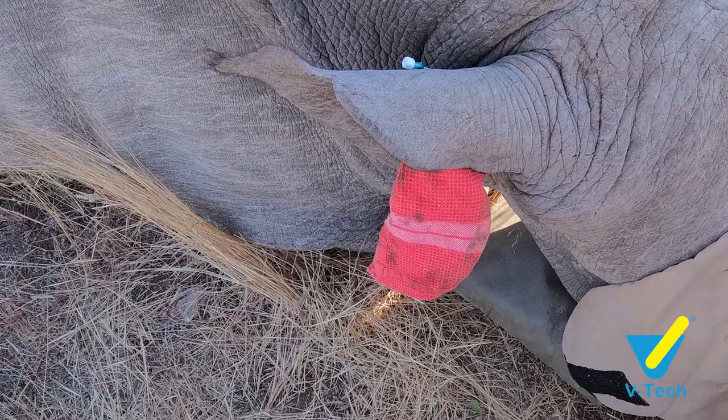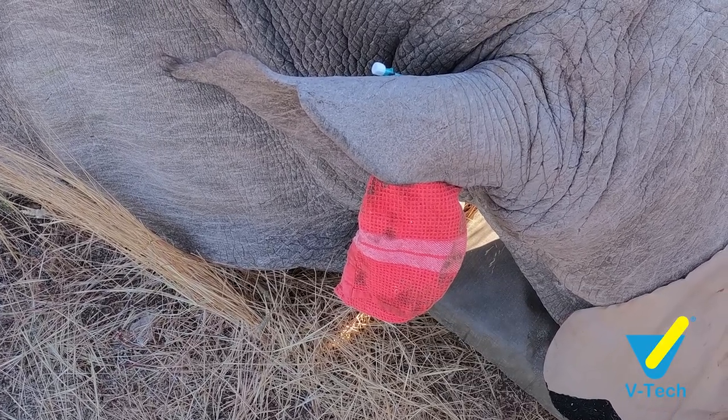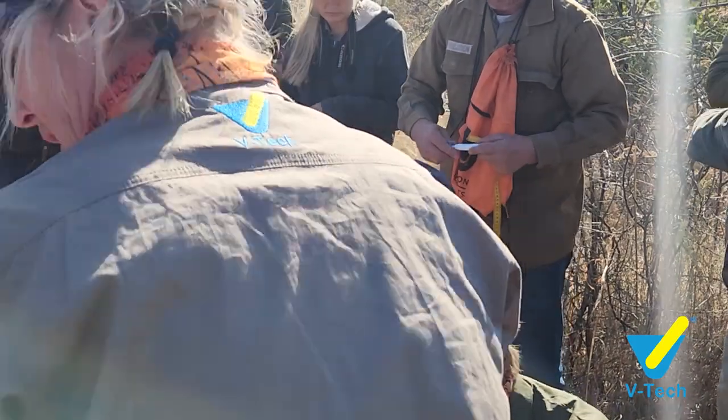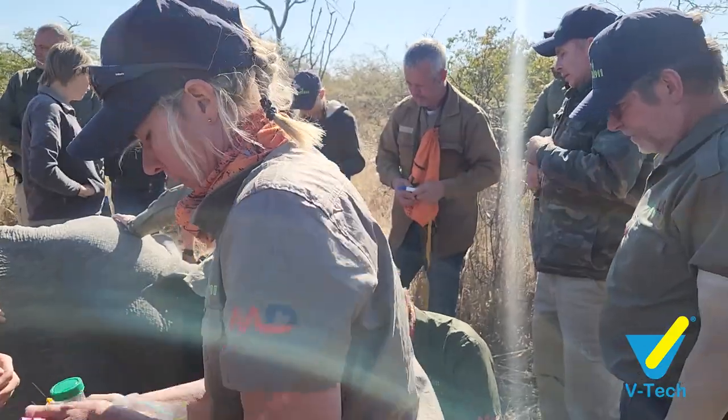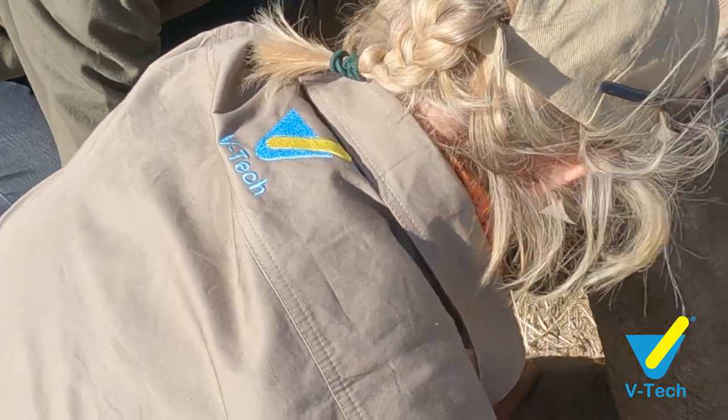If it is a calf, however, and you need the ear veins for drip access, there's another spot we can use. This alternative spot is for taking a blood sample for a test or DNA sample when the ear veins are not accessible.